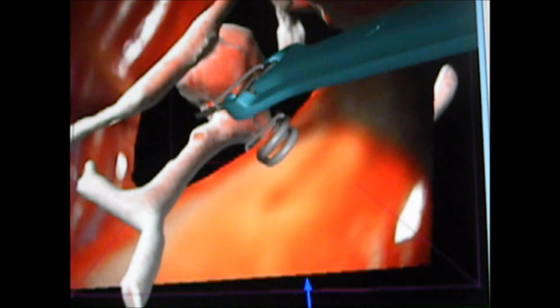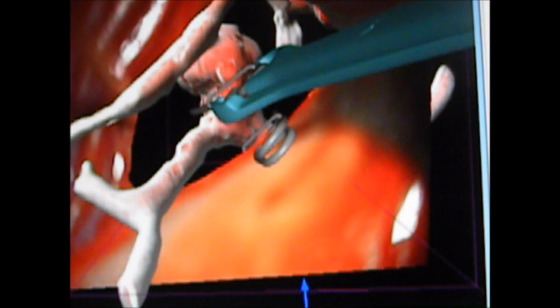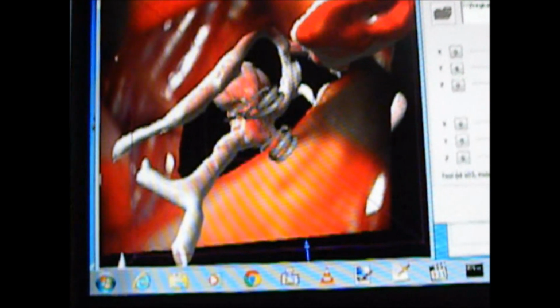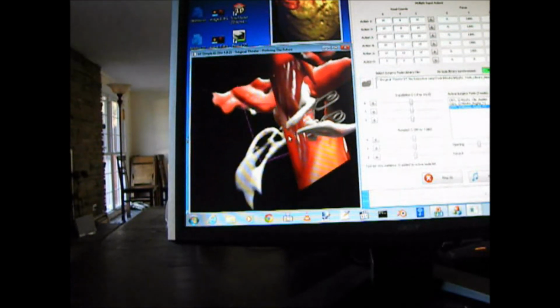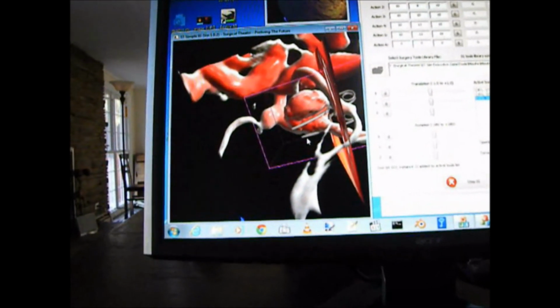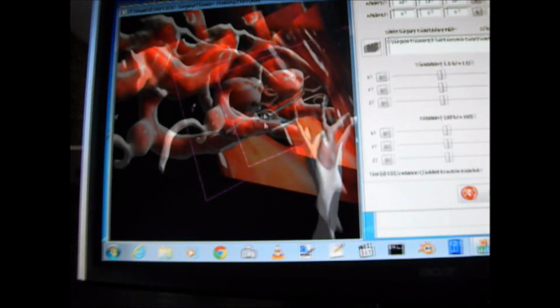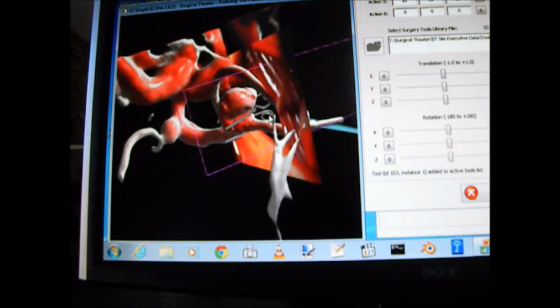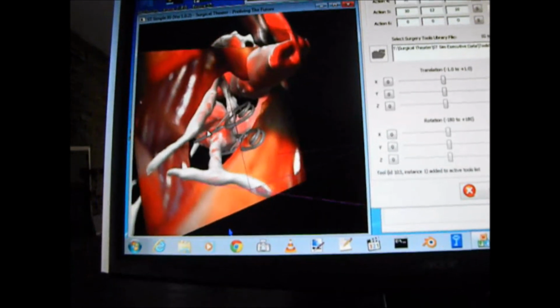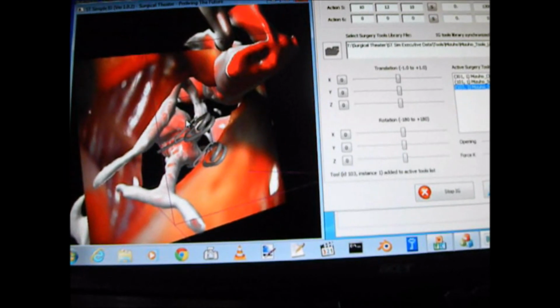The procedure that you are watching is the microsurgical clipping of a cerebral aneurysm in a patient who was treated just a few weeks ago. Now, the first session is performed by a surgeon who does not routinely do aneurysms, and you'll see that the novice chooses a straight clip to secure the aneurysm. Now, what you're seeing here is really the approach to the aneurysm as defined by exactly what we saw at surgery, the patient's own anatomy, and you can see the novice trying to put the clip on the aneurysm, and really we'll find out that that's not the best way to do it.